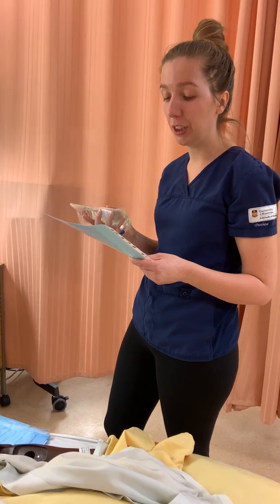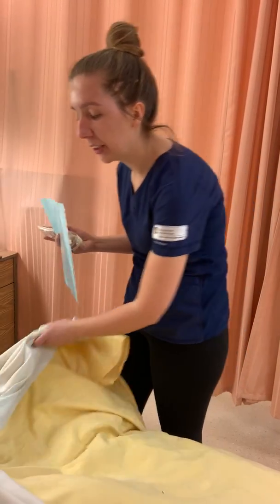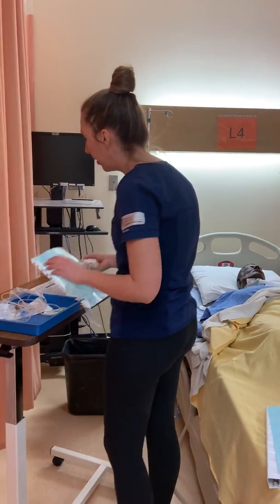It's to be given via continuous IV. This is appropriate for continuous IV, the right route, and the next time and frequency is now. So I'm going to come over to the side of the bed. I've completed my third check. I'm now going to educate my patient on this drug.